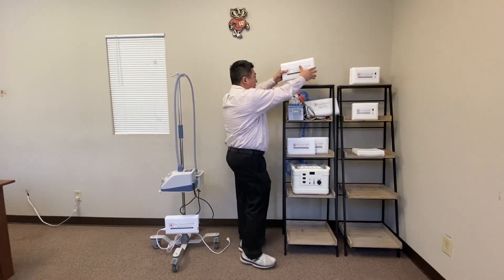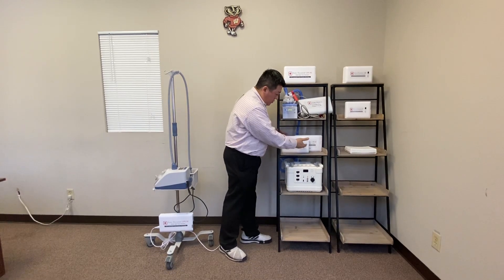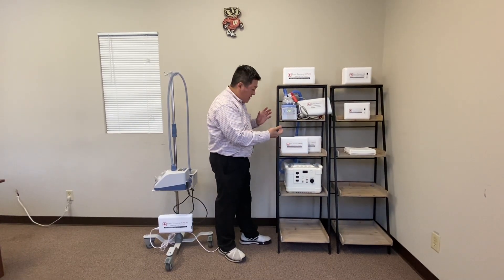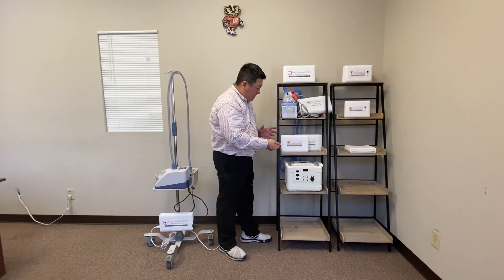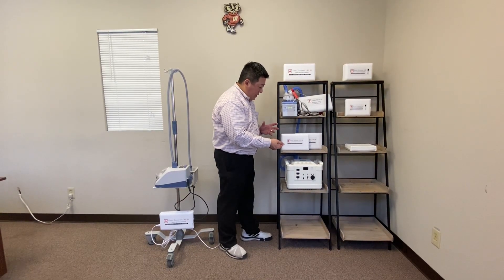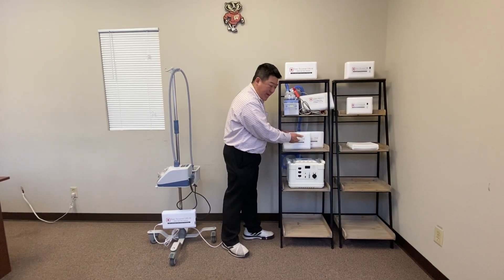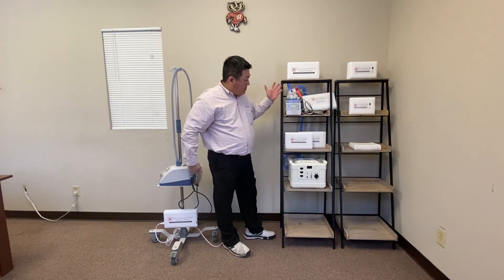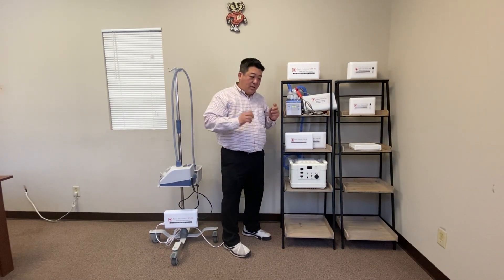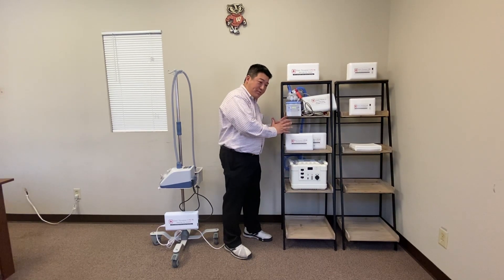We also have an Air Medical version that's FAA compliant. We call it the UPS 60. It runs 60 minutes at 37 degrees Celsius and 60 liters per minute. It also runs Ticotherm for 90 minutes. Both UPS 90 and UPS 60 run the device and charge the battery at the same time.